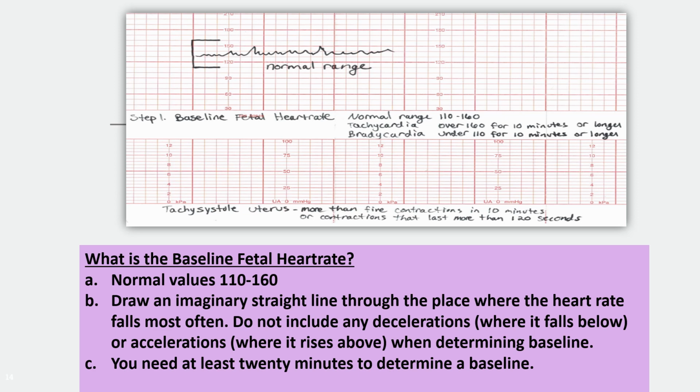You do need at least 20 minutes to determine a baseline, like for sure. If you just have a little finite period of time where you're concerned, you might look at at least 10 minutes and go by that. But if say you have a patient coming in for an induction, you really want a good full 20 minutes to determine what's going on before you start anything.